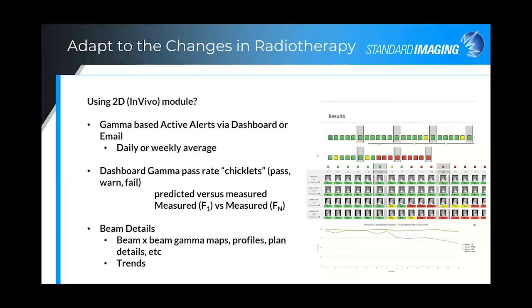This sample data we received from a clinic, and I don't know the clinical details for this particular example. My intent with this slide is to provide some background on tools that we can use for review of the daily EPID panel measurements and indicators that are needed to adapt the plan, should you want to explore further. We are considering other metrics that may be helpful in determining when to consider replanning.